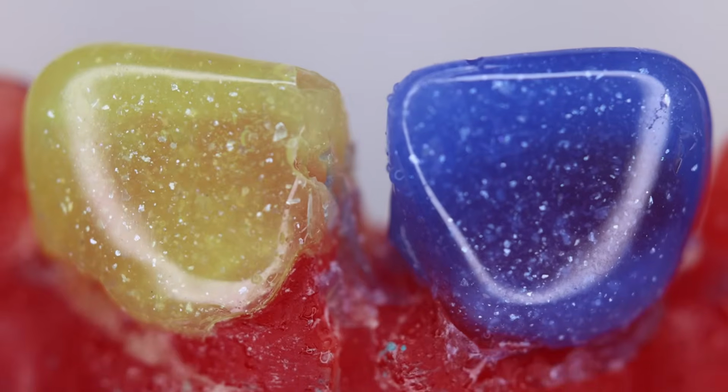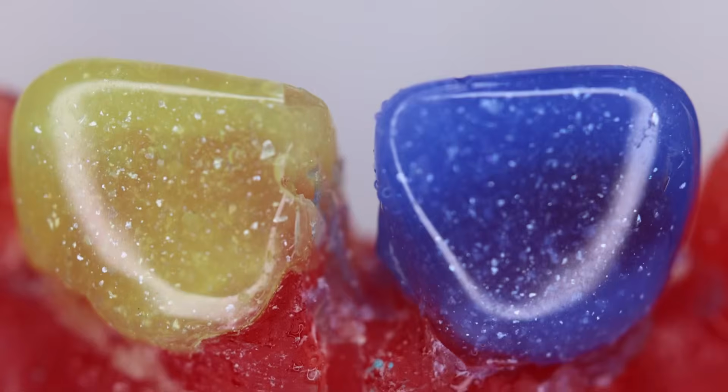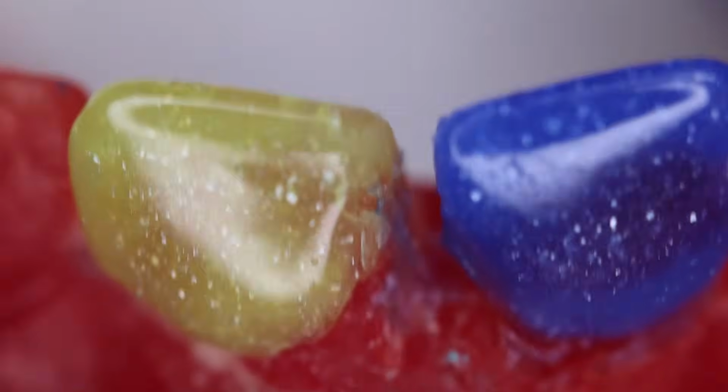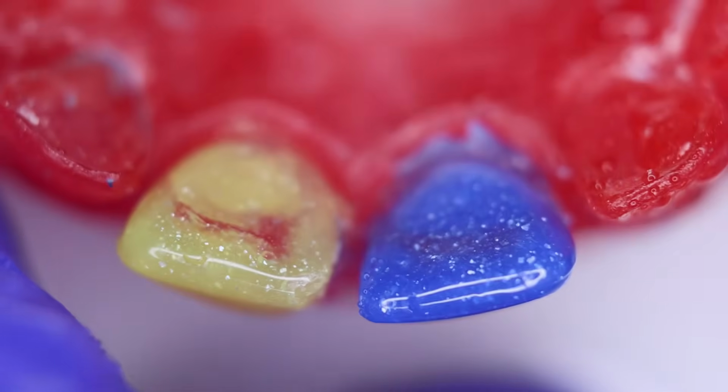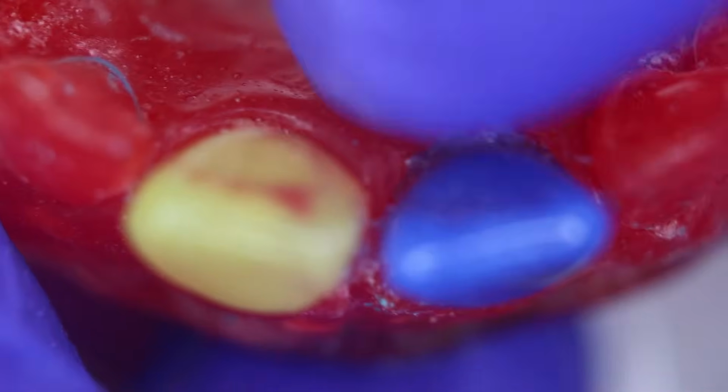So I hope you were able to understand this, and hope you liked it. We could still do more finishing over here, so we'll do that. So hope the basic idea is clear to you, and how our blue tooth looks.